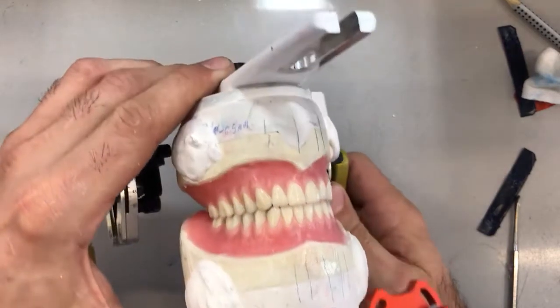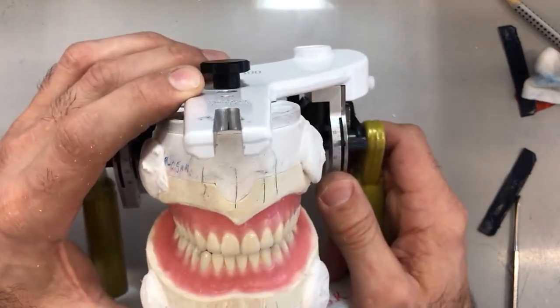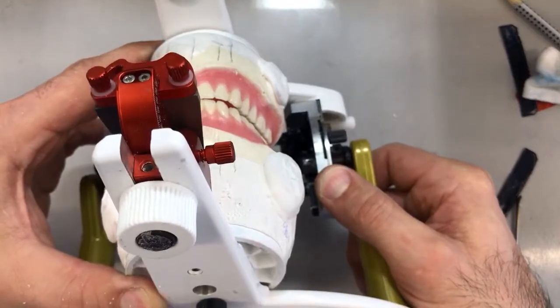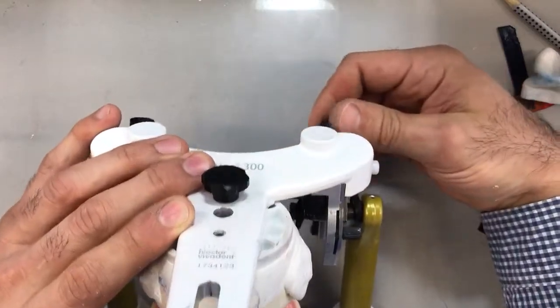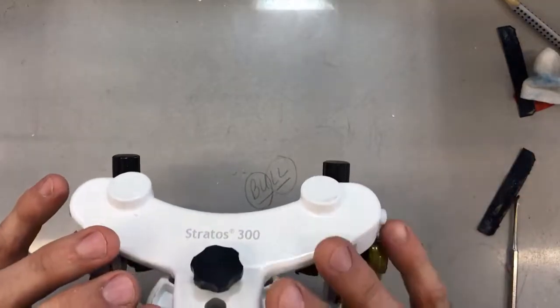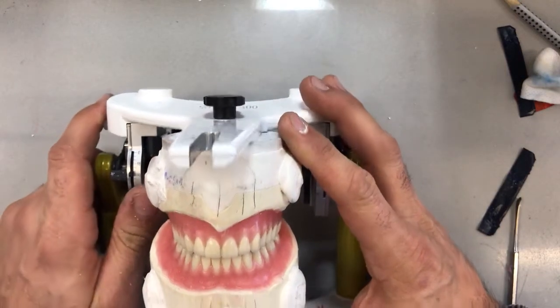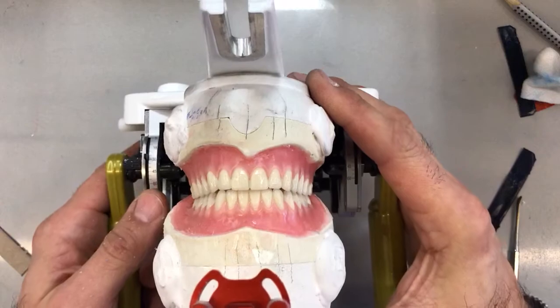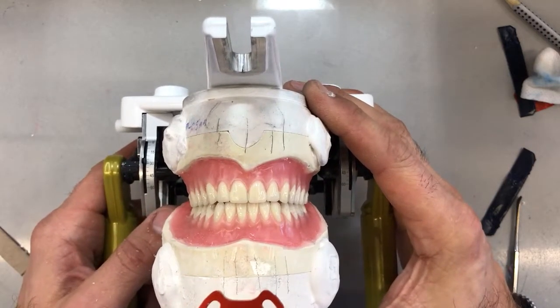Let's see how this looks now — shifting it over: absolutely no interference whatsoever. I don't feel any interruptions in that transition, the incisal edges are touching, and the balancing side is there. Now you want to do the reverse: lock the centric latch on the side you had opened, open the other one, and do the reverse. I'm going to do that off camera to shorten the video, and then we'll come back and I'll show you the protrusive record, which will be the final stage of our occlusal equilibration.